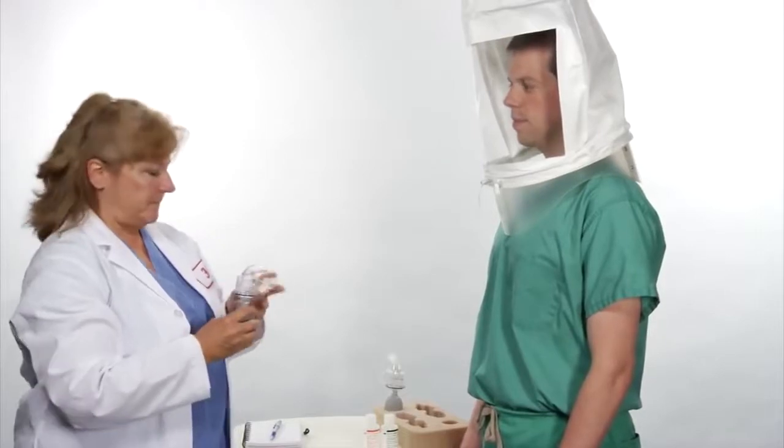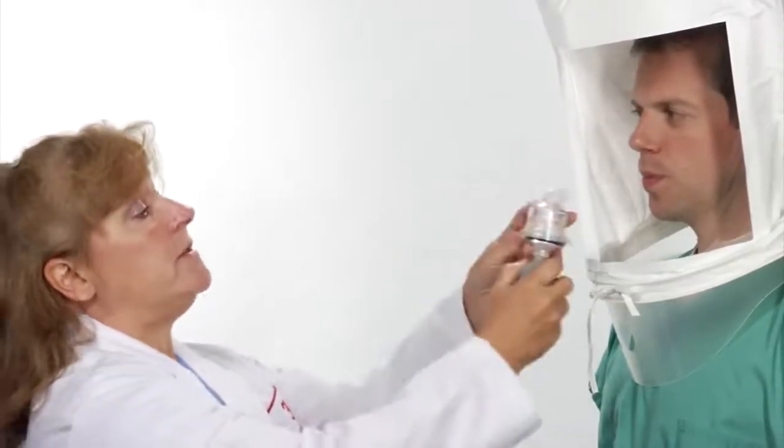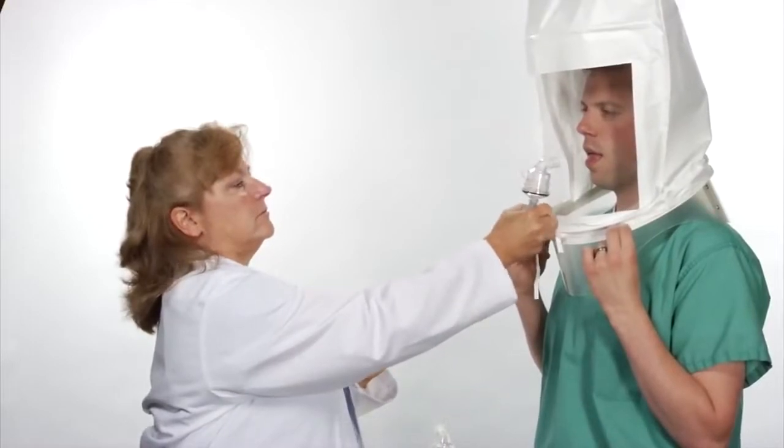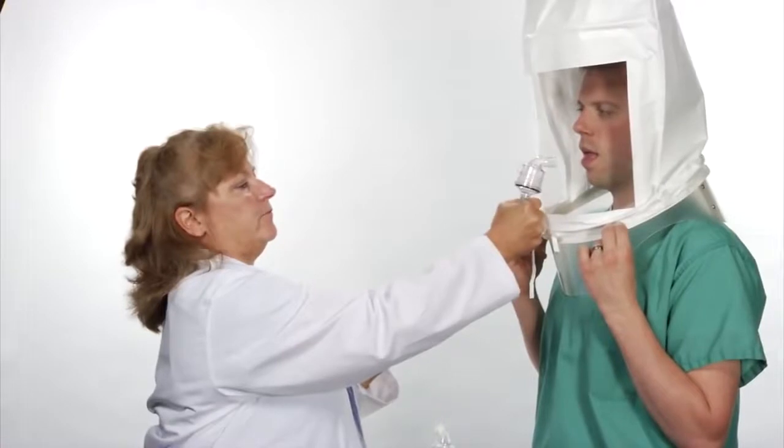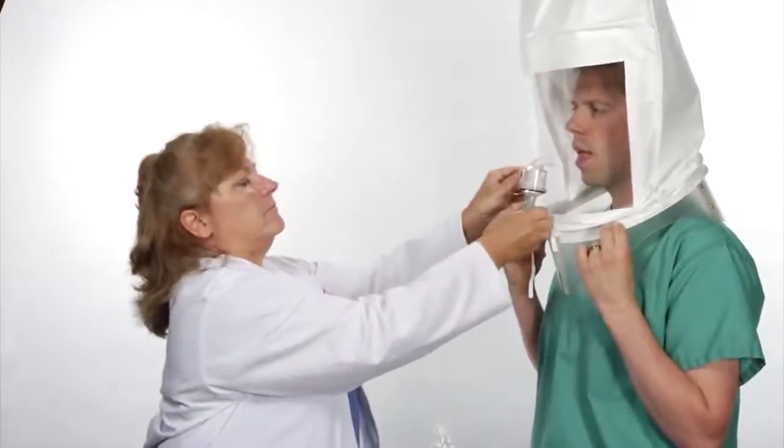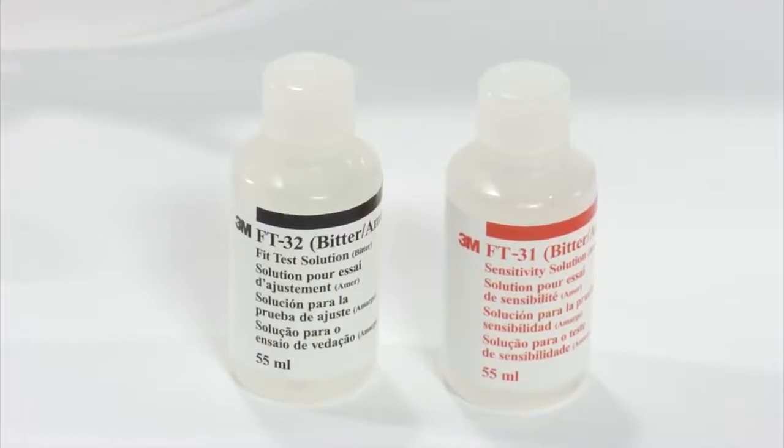Ask the test subject if they can taste the sweet taste of the solution. If the test subject can taste the solution during the 10 squeezes, note the number of squeezes as 10 and proceed to the fit test. If the test subject cannot taste the solution during the 10 squeezes, inject an additional 10 squeezes of the aerosol into the hood and see if the test subject can taste the solution at this time. Repeat with 10 additional squeezes up to a total of 30 if necessary. Note whether the test subject can taste the solution after 20 or 30 squeezes. If the test subject is unable to taste the solution after 30 squeezes, end the test. Another fit test method must be used for this test subject such as use of the FT32 bitter solution or a quantitative fit test method. Remove the test hood from the subject. Give the subject a few minutes to clear the taste from their mouth. The test subject may help clear the taste of the test solution by rinsing their mouth with water.